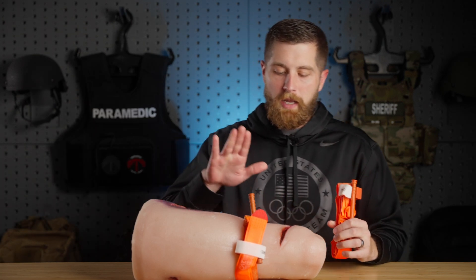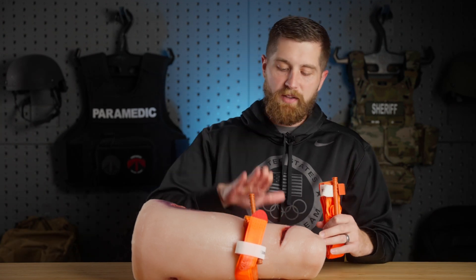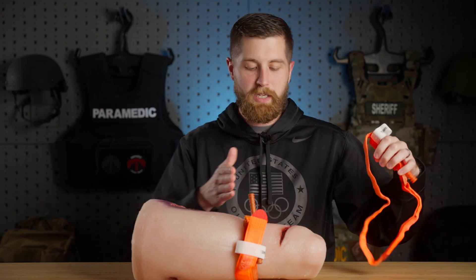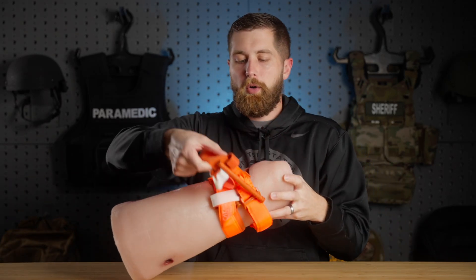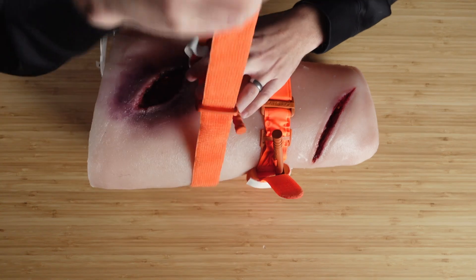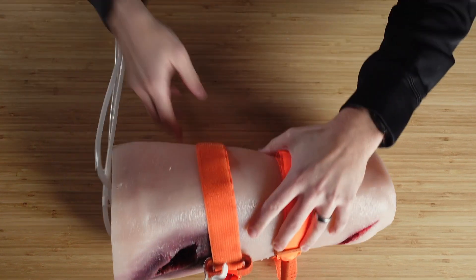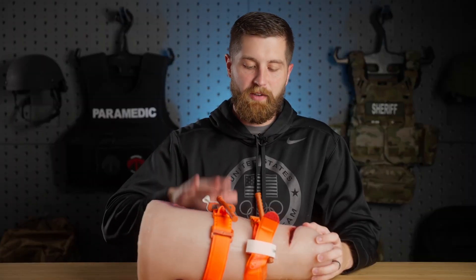We have to do some things to set ourselves up for success. The first thing I want to do is take a plus-one tourniquet and apply it to the patient. If the first tourniquet is two to three inches above the wound, I'm going to place this one two to three inches above that tourniquet. If the original was placed high and tight on the extremity, I'll put the secondary two to three inches above the wound — as close to the wound as possible. I'm going to put this on and tighten the strap but not turn the windlass at all, so it's in place and I'm ready to go if I need to apply it.